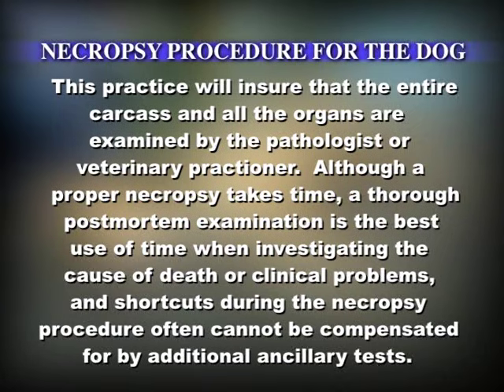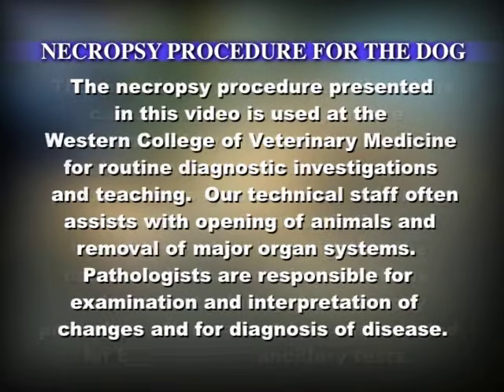Although a proper necropsy takes time, a thorough postmortem examination is the best use of time when investigating the cause of death or clinical problems, and shortcuts taken during the necropsy procedure often cannot be compensated for by additional ancillary tests.